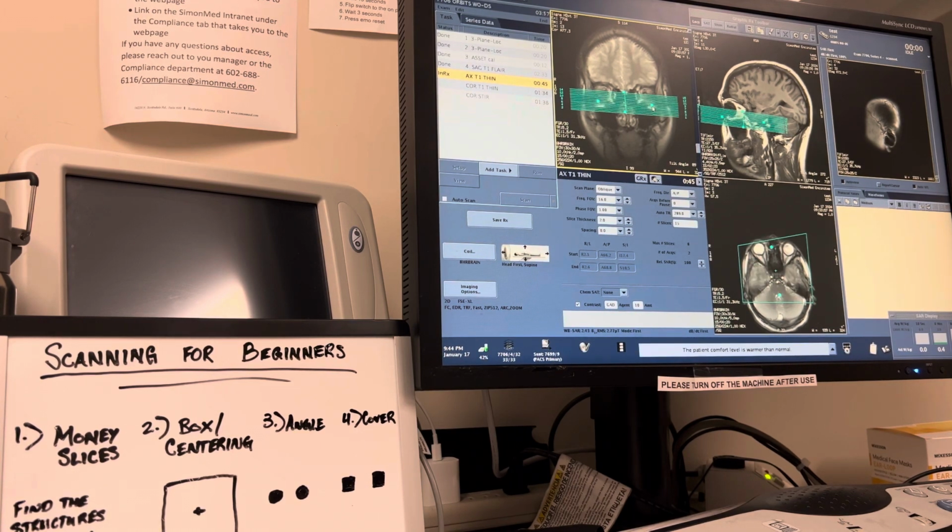A little bit more. You said middle click? No, left click and grab it and go out wide. That way it's not as sensitive. Yeah, there you go. And go a little bit more. Oh, okay, not a little less, just a tiny bit less. Perfect, right there. Okay, and we can double check by going down, and we'll check with the globes.